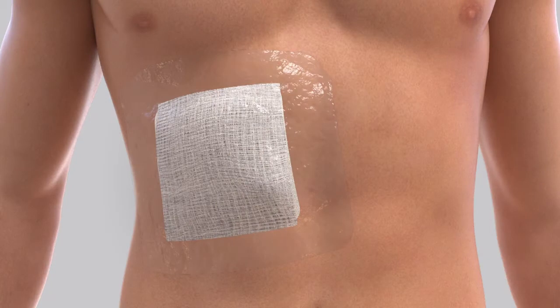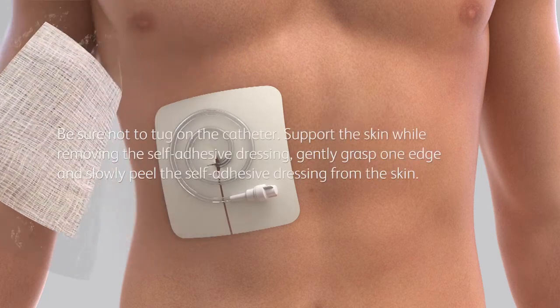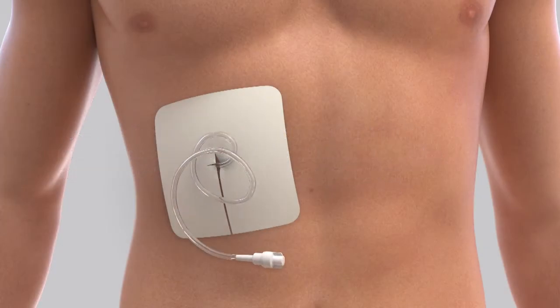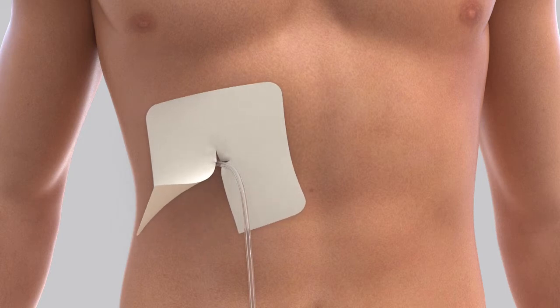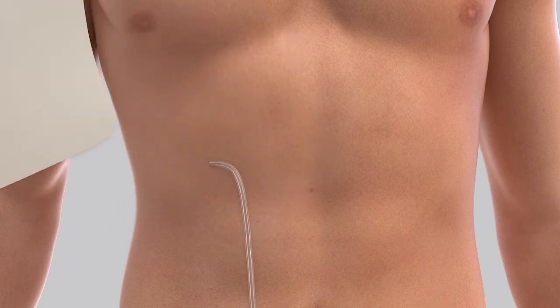Remove the dressing from the area around the catheter and discard it. Be sure not to tug on the catheter. Support the skin while removing the self-adhesive dressing — gently grasp one edge and slowly peel it from the skin. If you notice any redness or swelling around the catheter, any fluid leaking, or if the white cuff is visible on the outside of your body, continue the drainage procedure and then call your doctor or nurse to report what you see.